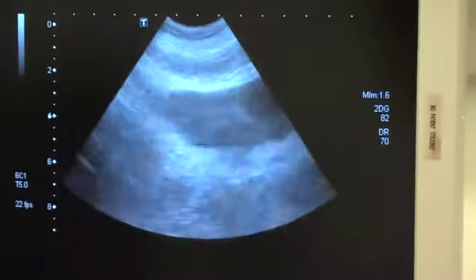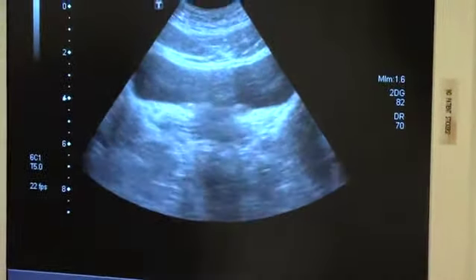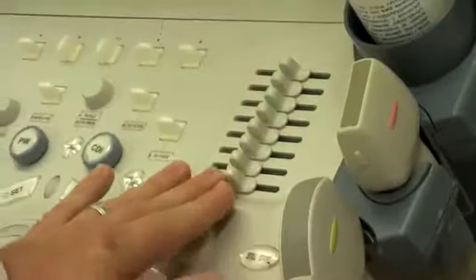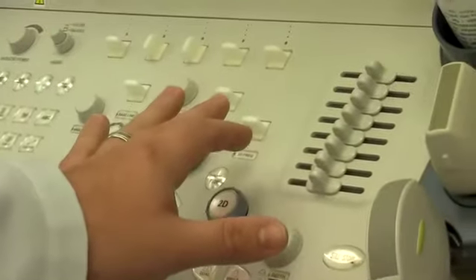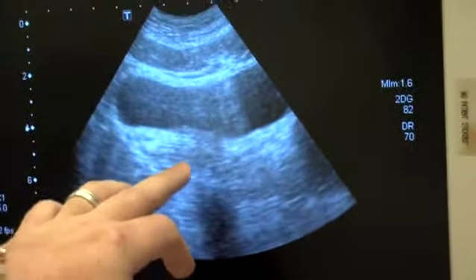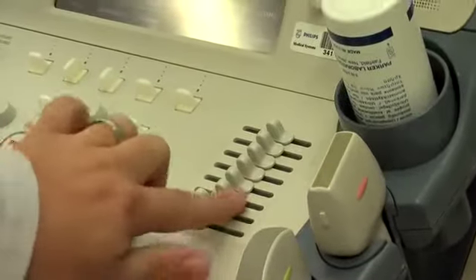Another thing I want to point out on the machine: there's a function called time gain compensation, or TGC. That's these things over here. What that does is, instead of the gain changing the brightness overall for the entire screen, that'll change the brightness at a certain level of the screen. So in this view, oftentimes because of posterior acoustic enhancement, the far field is much brighter than it normally should be. So you can turn down the gain a little bit by moving these buttons down, and it makes it less bright in the far field.